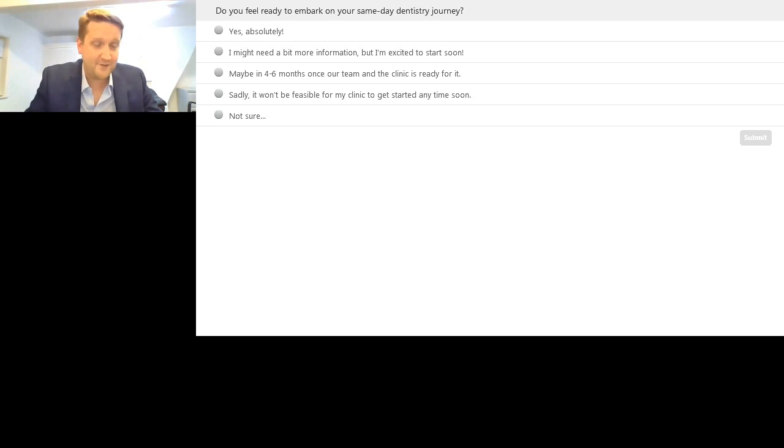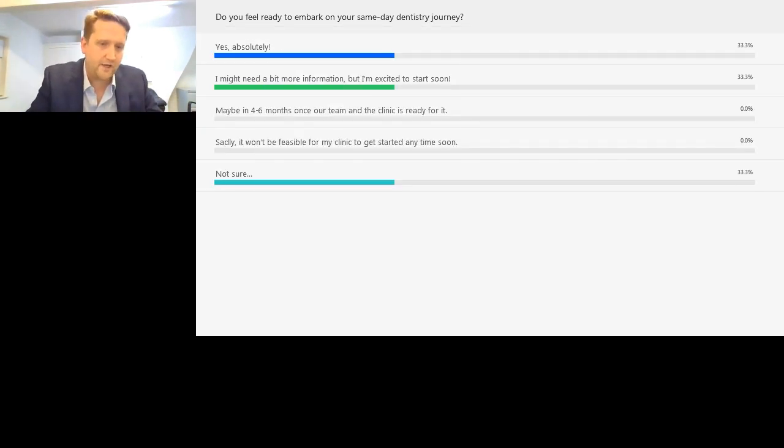I have actually done add-on ceramics since they taught me how to do that. But if they watch this and I say I did it, they'll know I'm telling people that. But yeah, they helped me add on and showed me how to do that. So then that was fine. But after that, I've only had to do that in one case. The rest of the time since then I've adjusted it, so I have 0.08 on my interproximal contacts as my setting, and that just means I can do the fit, and I know I'm going to get a tight floss through it, but not too tight that I can't seat the crown down.